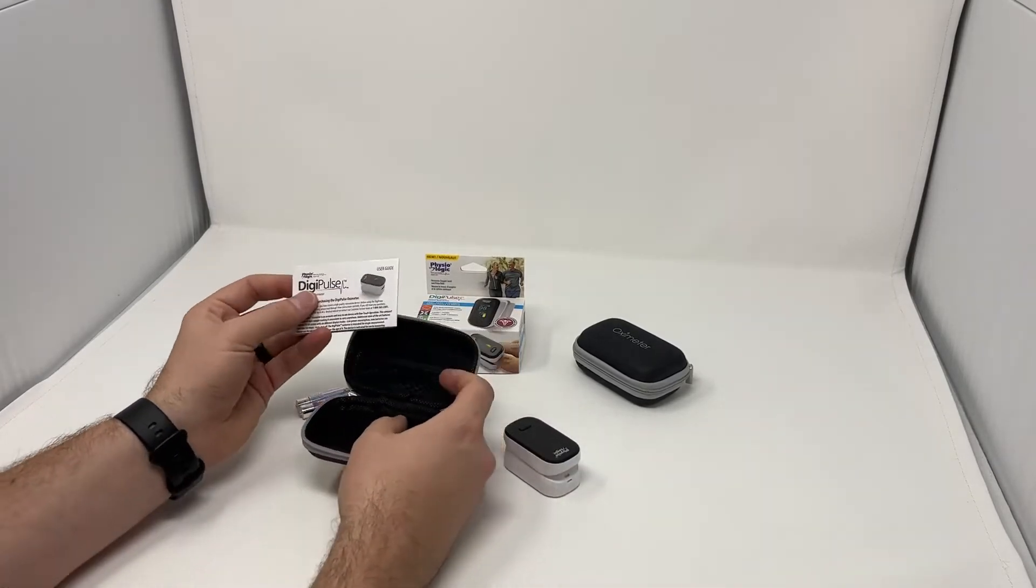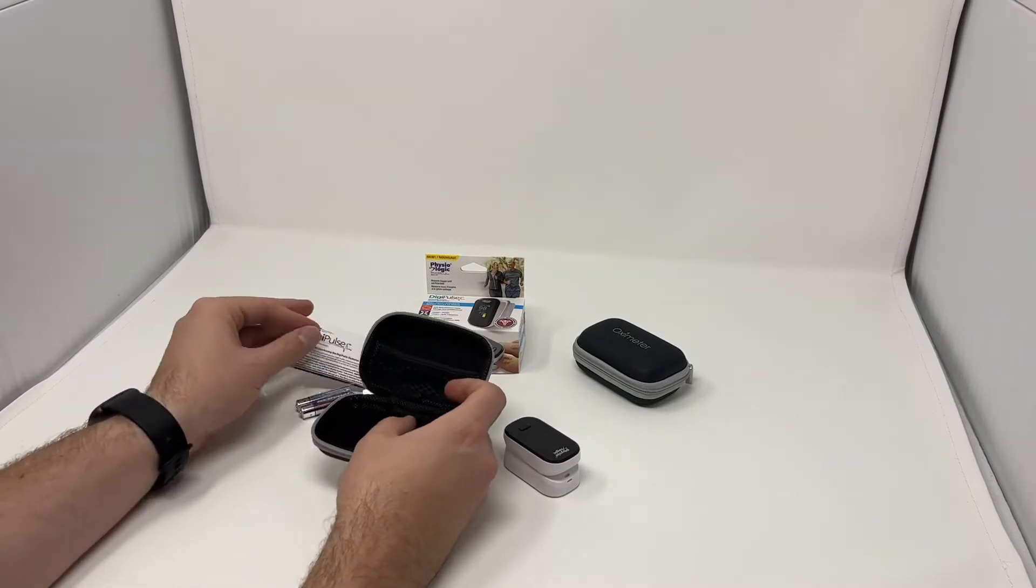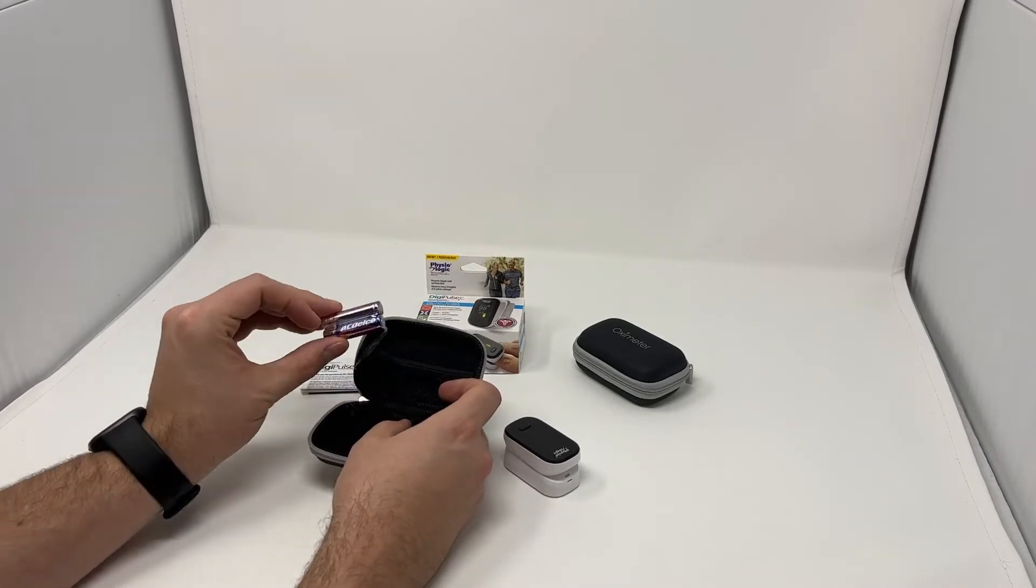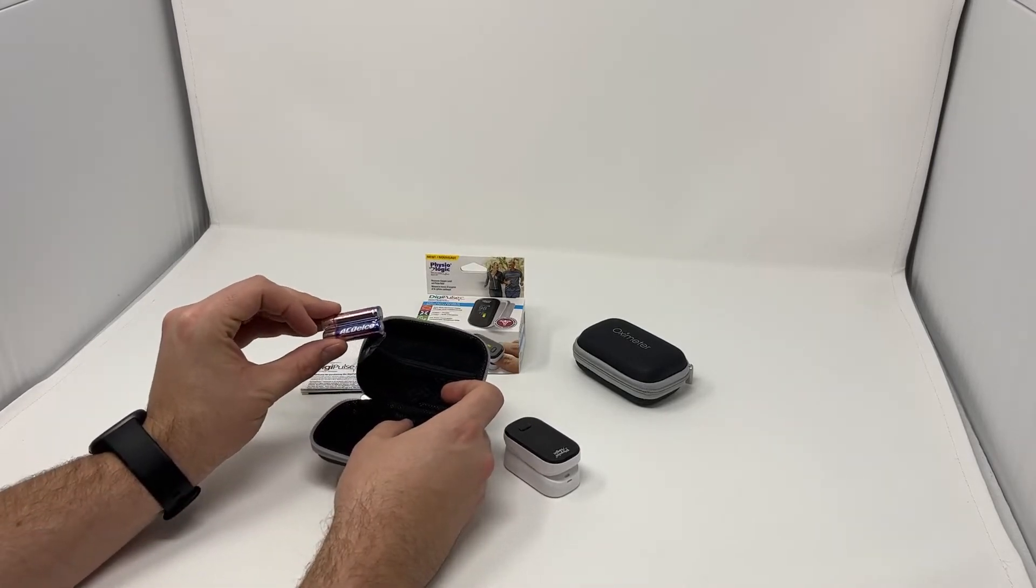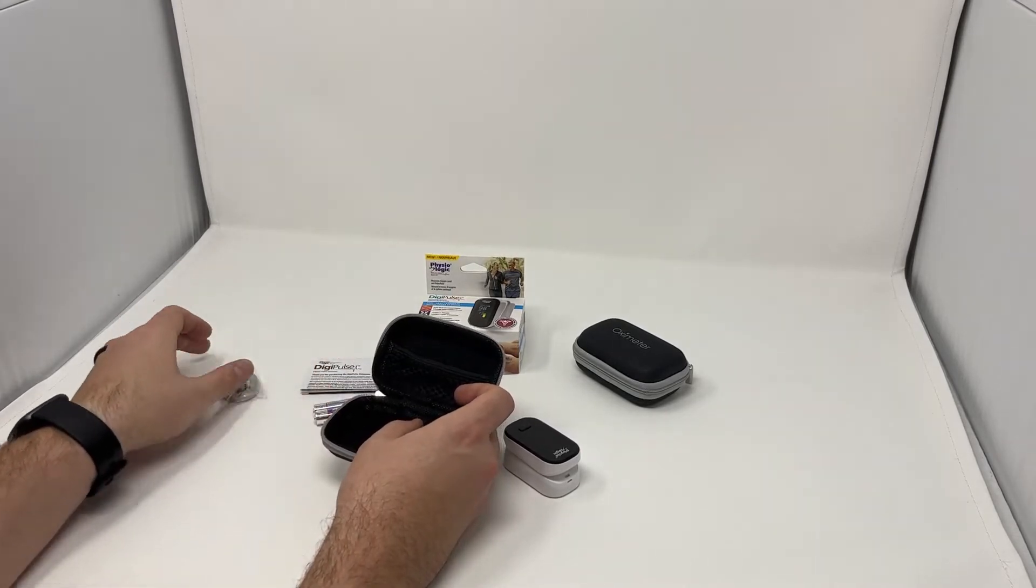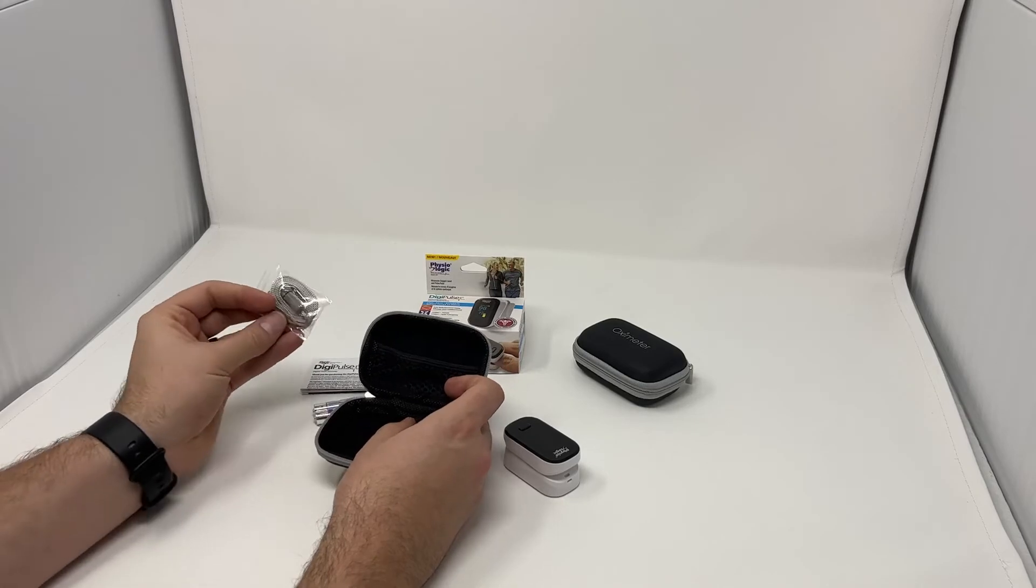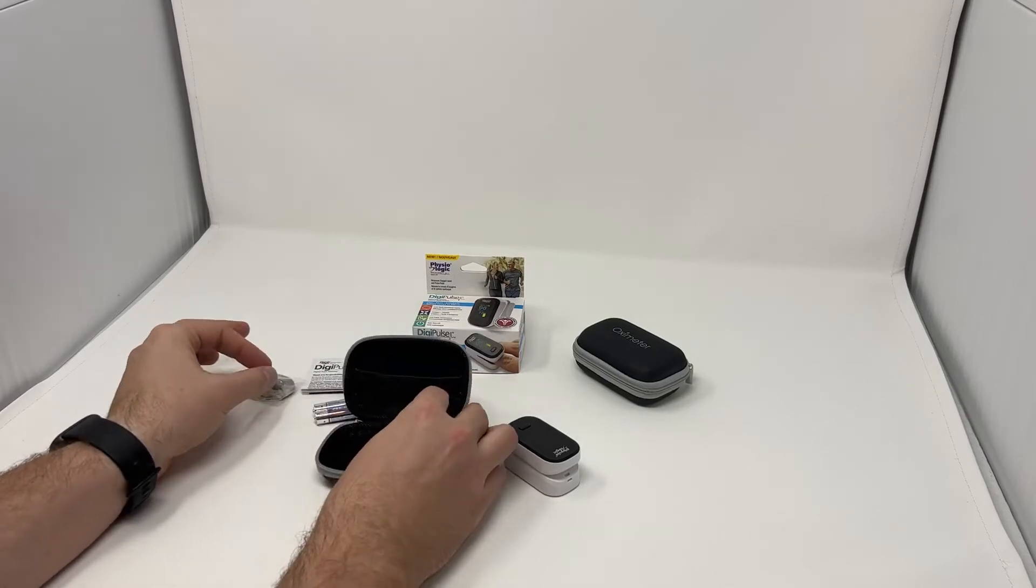You can keep your instruction guide in here. We also include two AAA batteries with all of our pulse oximeters and you're going to get your lanyard as well.